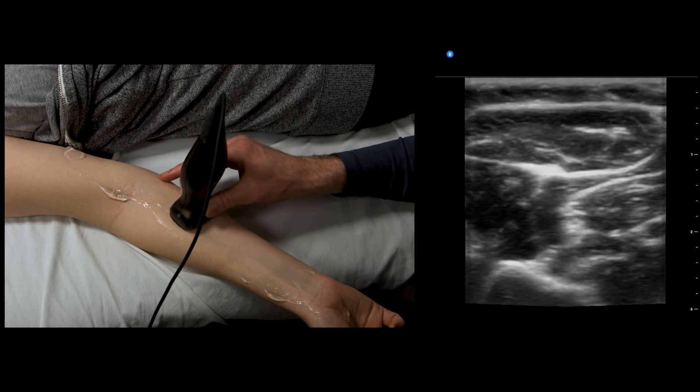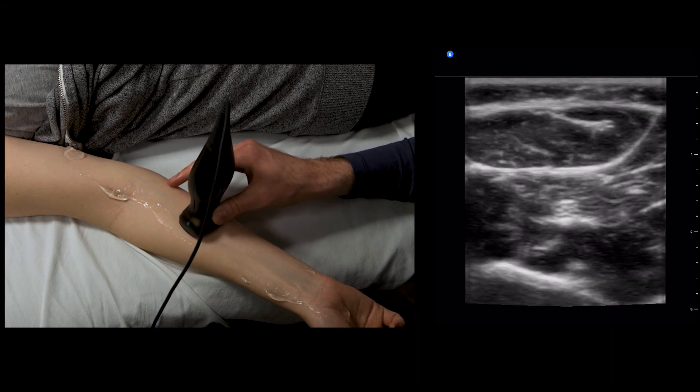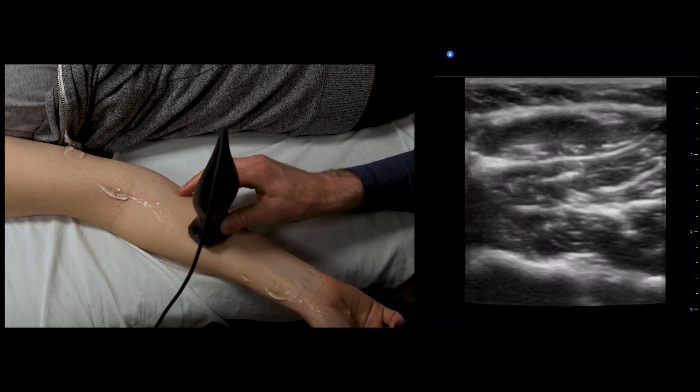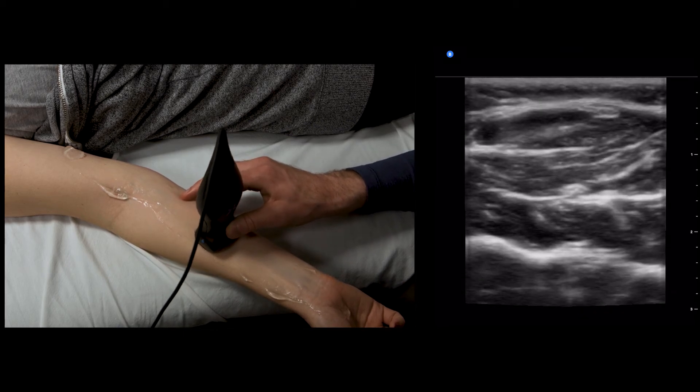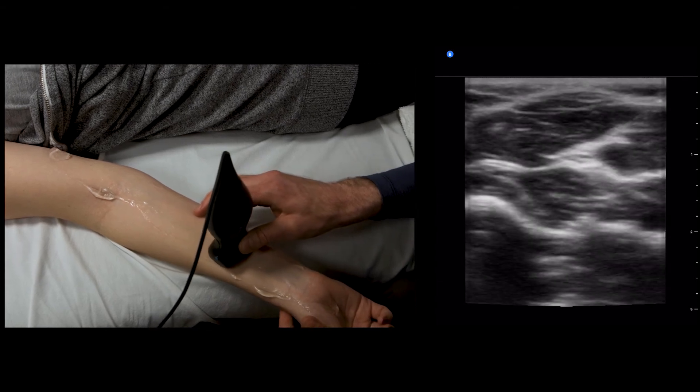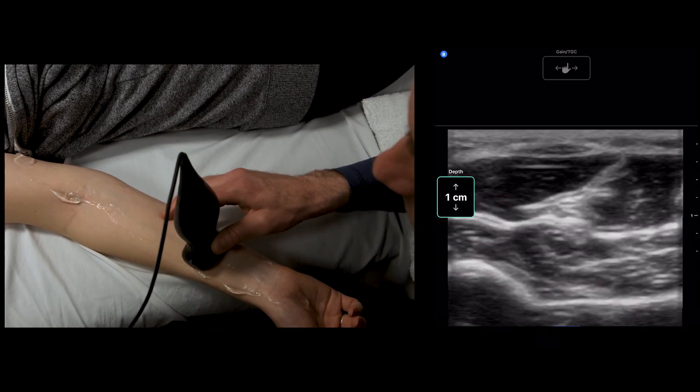And then it rises a little bit to become the defining structure in the forearm between the superficial and deep compartments. It rises superficial again.